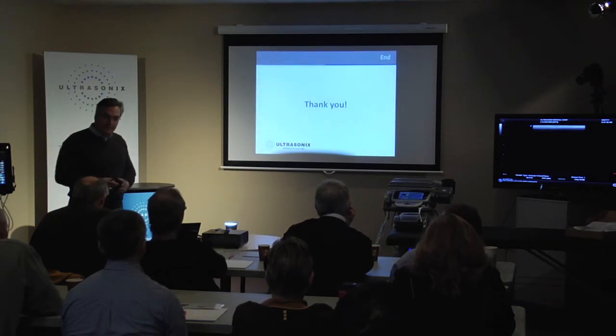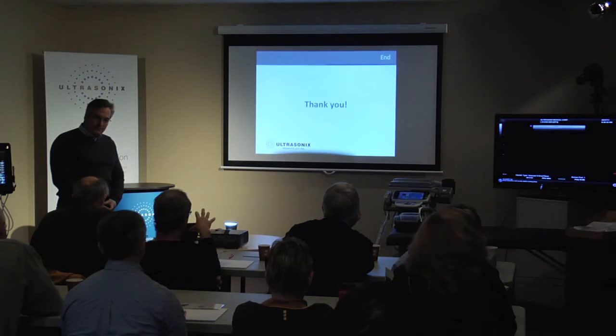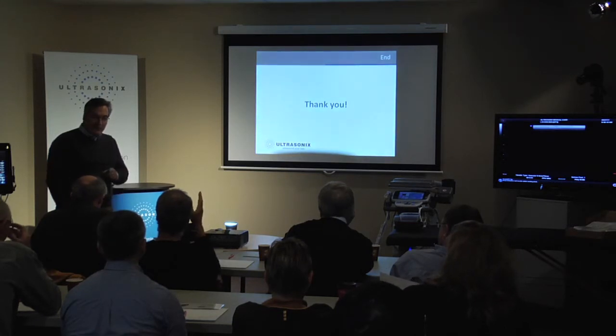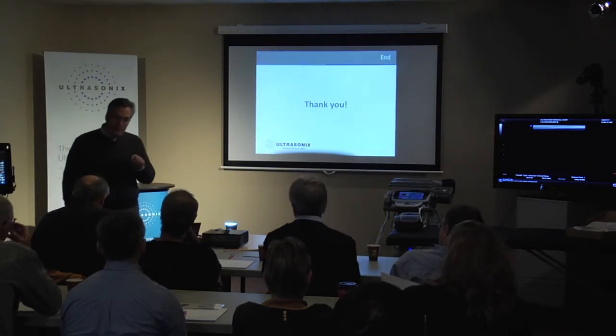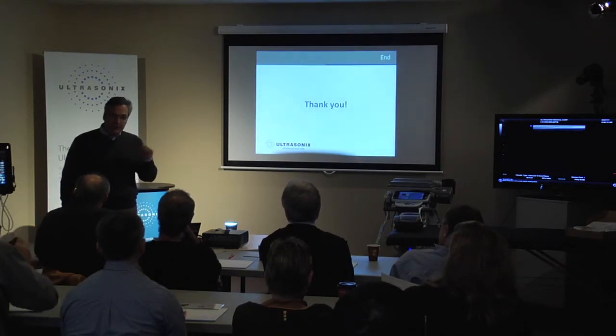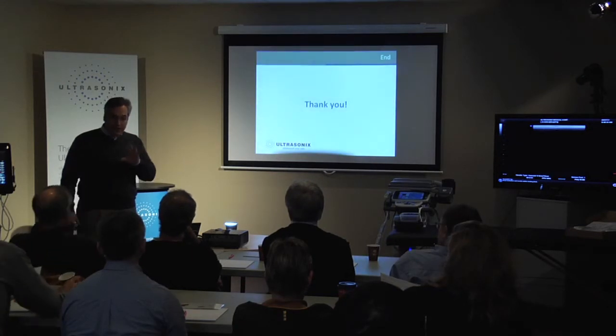Just a fairly basic question, but when someone is manipulating the various parameters and adjusting them, and the next time you do a study, is everything reset to a certain preset point? It's a very good point. Those attributes that you've changed can easily be saved under a label that you define for easy identification the next time you repeat that same protocol. So you can capture or save your choice of presets so they're available to you in the future.